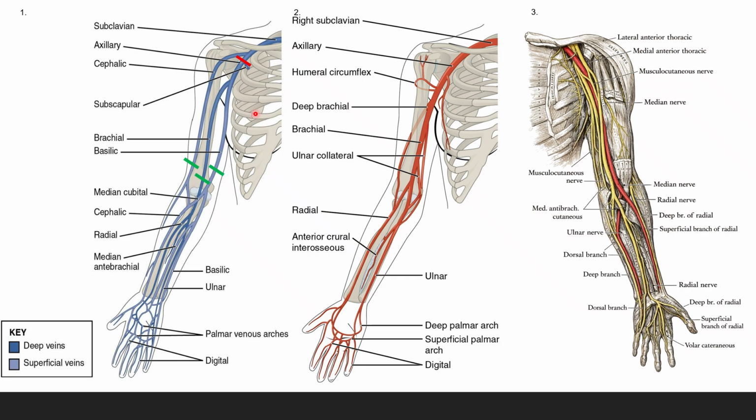And then also remember that some of our patients may be surviving breast cancer patients or current breast cancer patients. When they do those lymph node dissections, they may have trouble draining along that area. So they've had that history too. May need to avoid doing these sticks on these deeper veins.